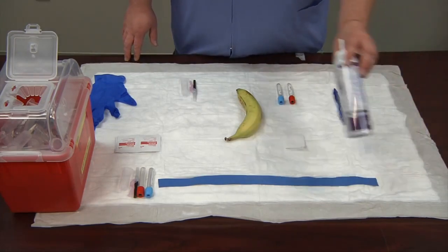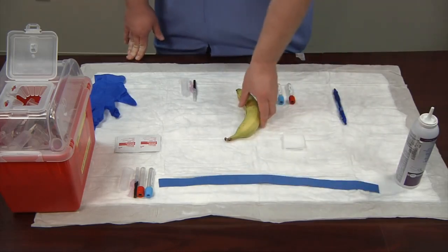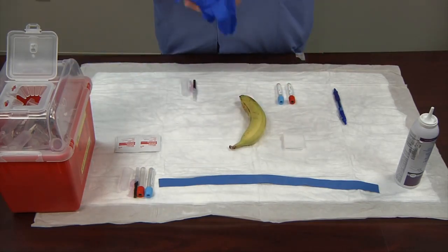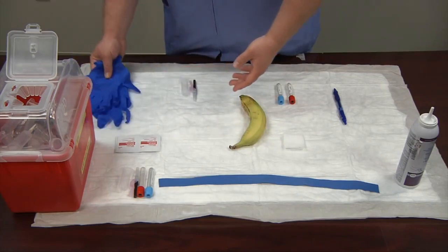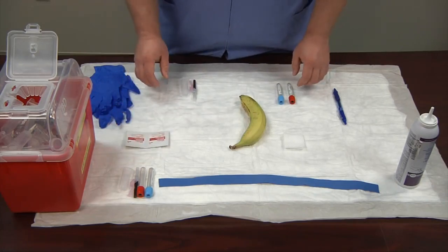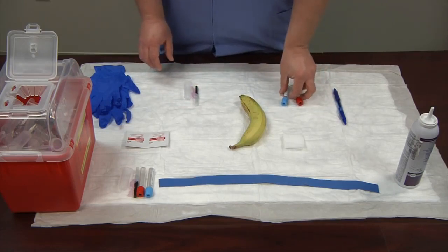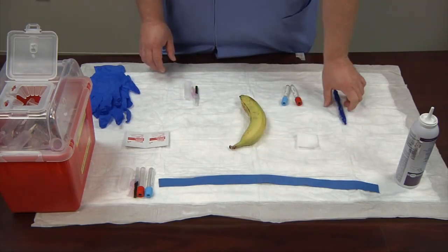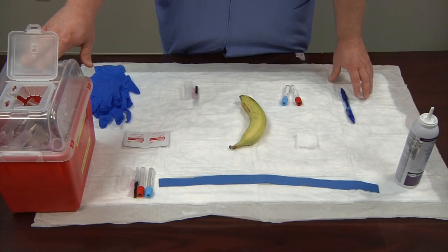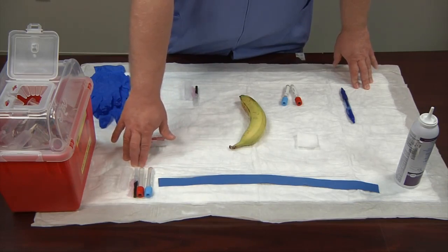The supplies you'll need to do a banana blood draw: hand sanitizer, your tourniquet, your banana — preferably a green one — your PPE (in this case gloves), your alcohol swabs with 70% isopropyl alcohol, your vacutainer needle and tubes, 2x2 gauze, and a pen to label with when you're done. Have your biohazard box nearby within arm's reach, and an extra needle and extra set of tubes in case of complications or loss of suction.